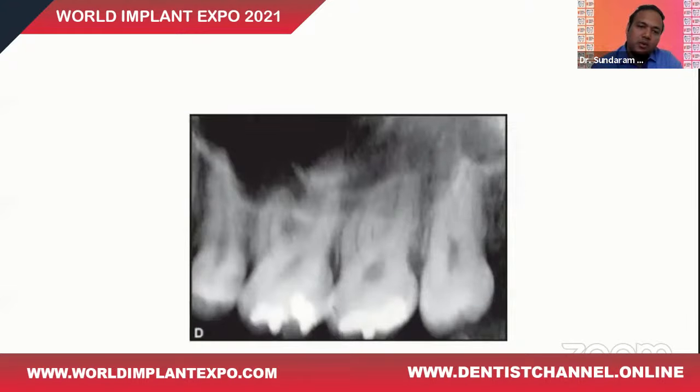And you get the same problem in the maxillary molars also. You get the sinus, but you're not sure how far the sinus is dropping. This image gives us a prediction that the maxillary molars are dipping into the sinus, but are they really going into the sinus, or is it a different plane? We have no idea.